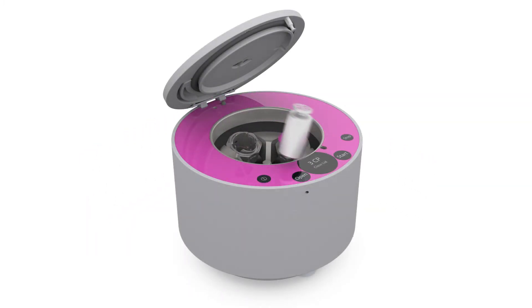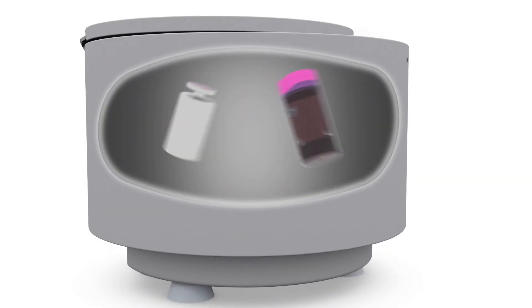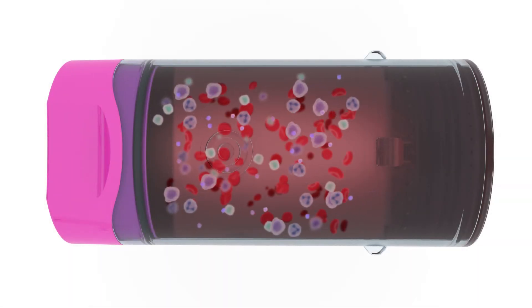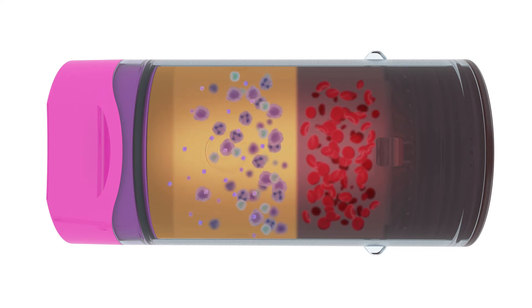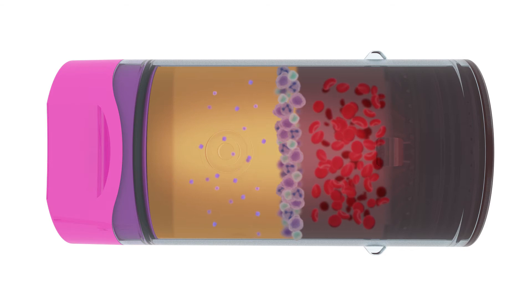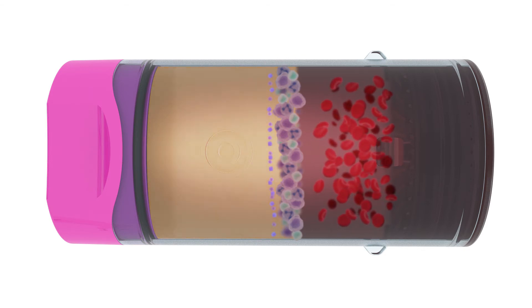The 3-CP centrifuge separates the key components using a proprietary centrifugation process, separating them into well-defined layers and allowing fibrin to polymerize during the coagulation step.